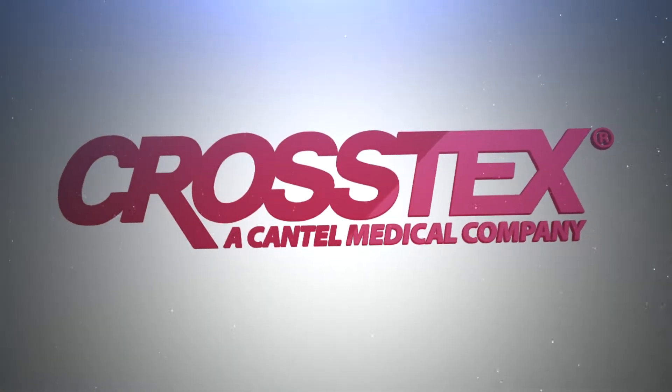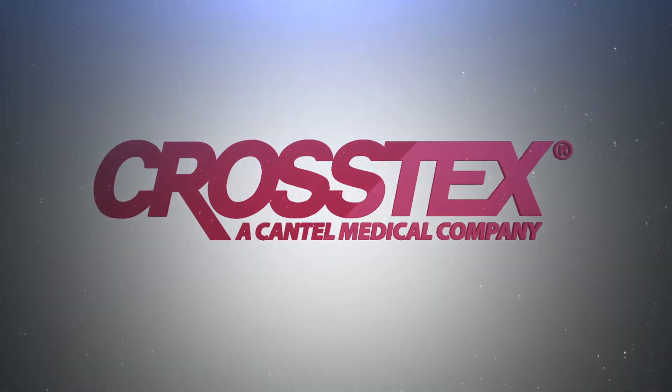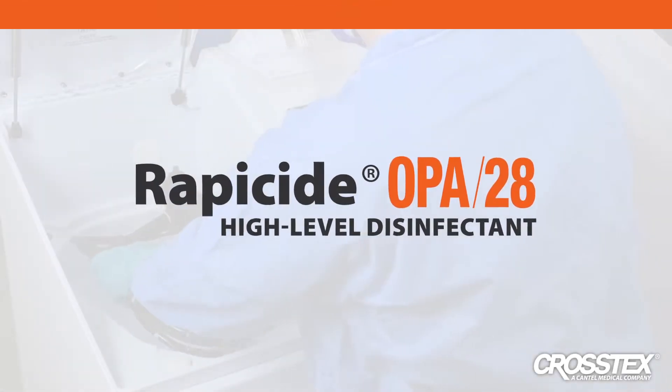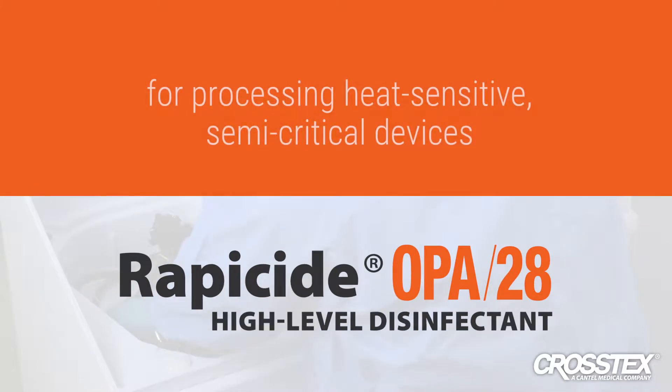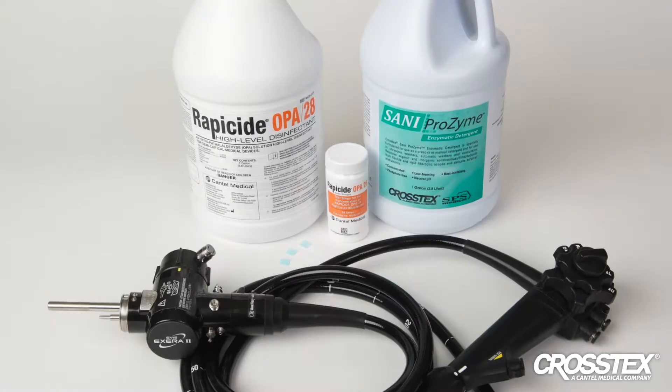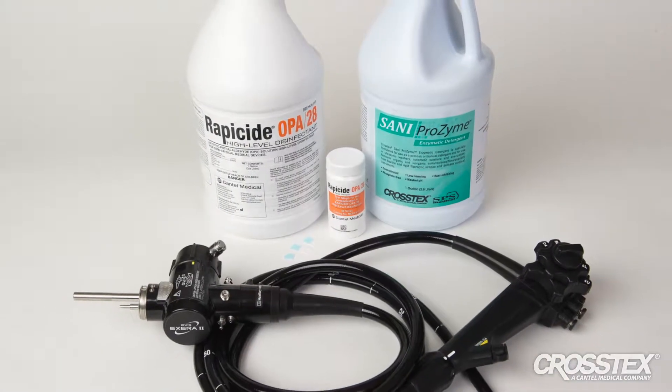The following video is intended to provide a basic overview of how to use Rappaside OPA28 high-level disinfectant for processing heat-sensitive semi-critical medical devices. This presentation does not take the place of the instructions for use which come with the product and must be read prior to use.